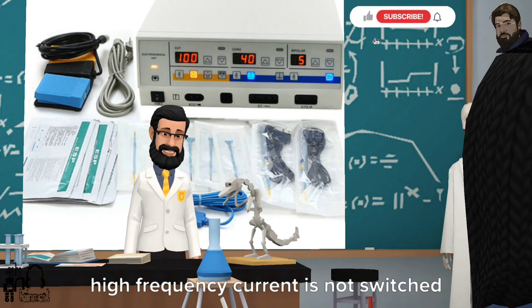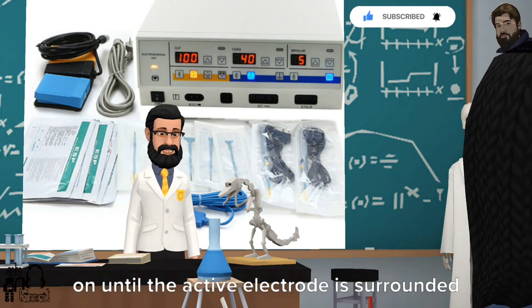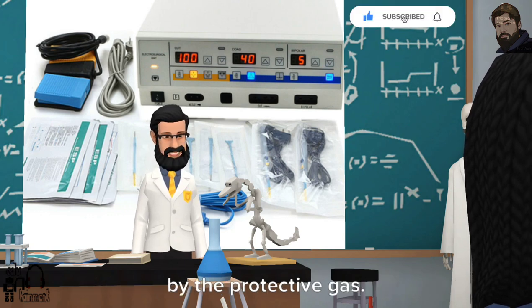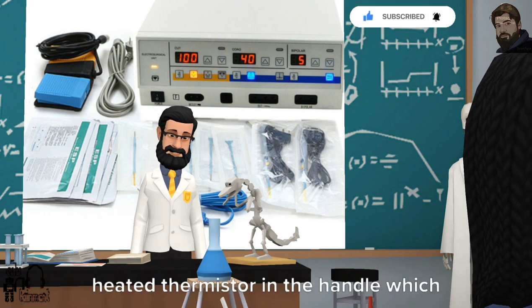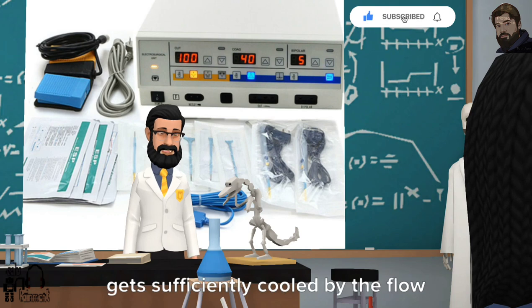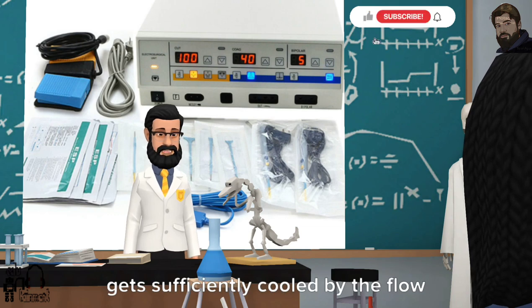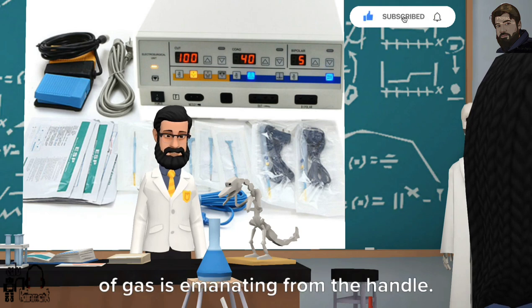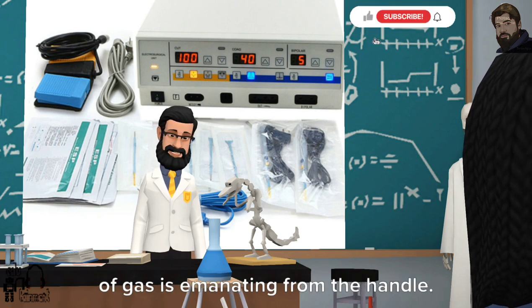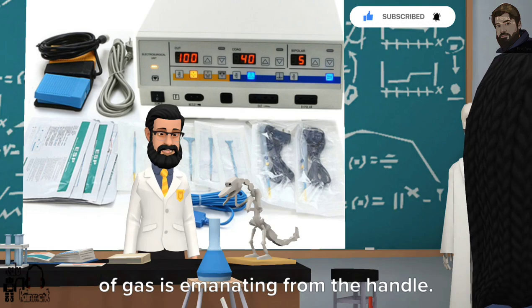An automatic control is incorporated in the unit which ensures that the high-frequency current is not switched on until the active electrode is surrounded by the protective gas. This is achieved by using an electrically heated thermistor in the handle which gets sufficiently cooled by the flow of protective gas. This ensures an adequate stream of gases emanating from the handle.